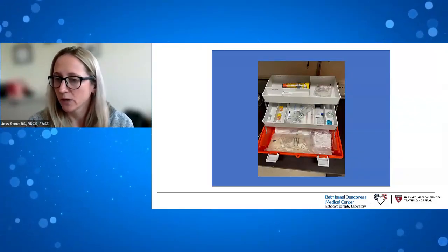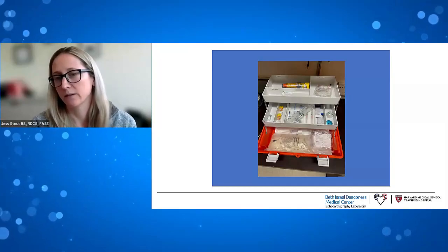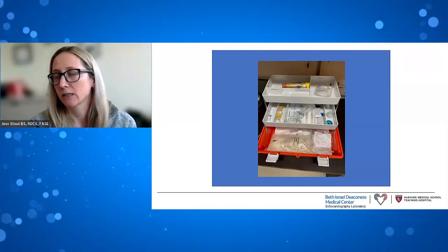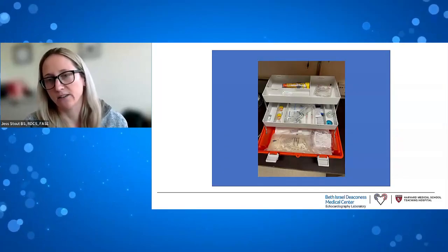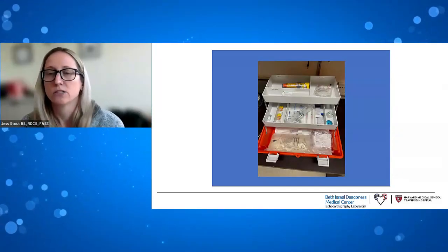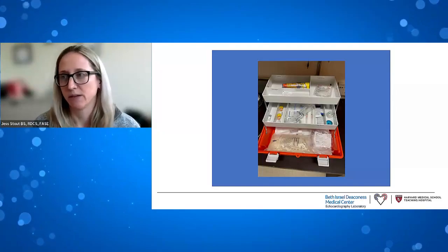locked with one of the code cart locks that has the numbers on it. So we do a weekly check and sign off that the lock hasn't been changed or tampered with. And then we do a monthly check and a check and change of any expired items, and then document that. All those documents are saved for reference later if needed by anybody. So they signed off on that. We also keep it in a locked cabinet because there are meds in there, so it needs to be in a locked area.